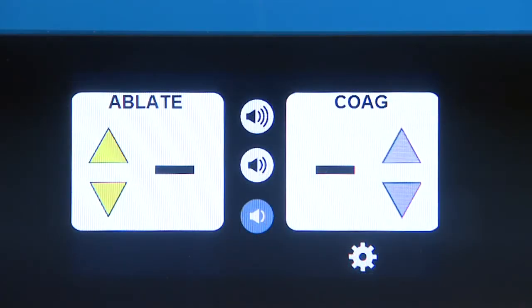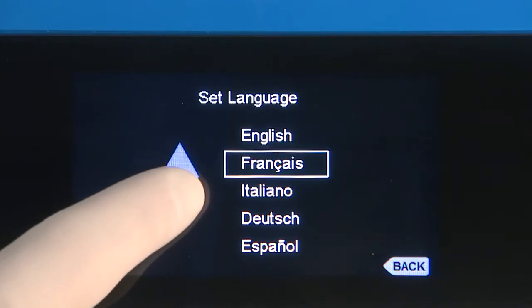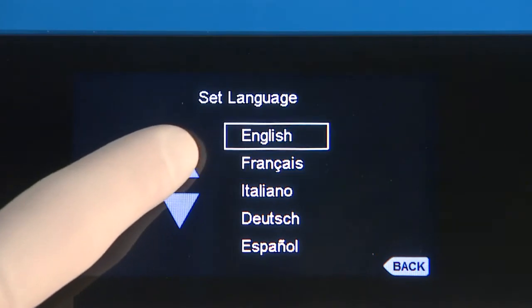To set up for the first time, touch the gear button to bring up the system settings, select language, and then scroll between the available languages. Make a selection and then hit the back button to save the choice.